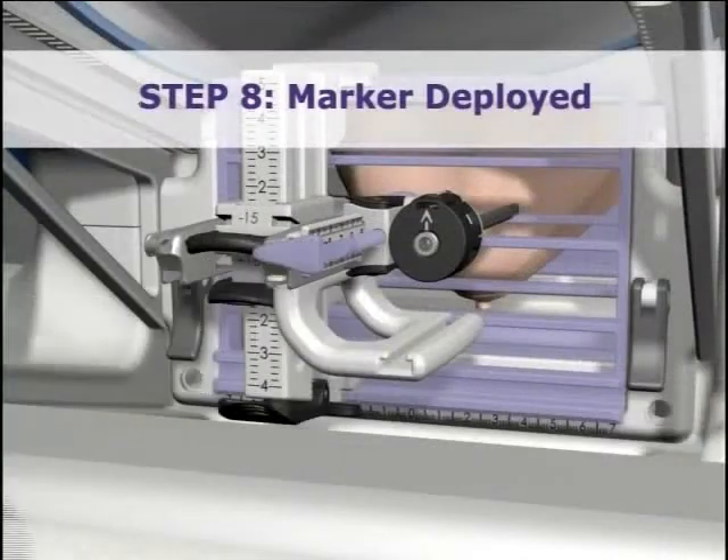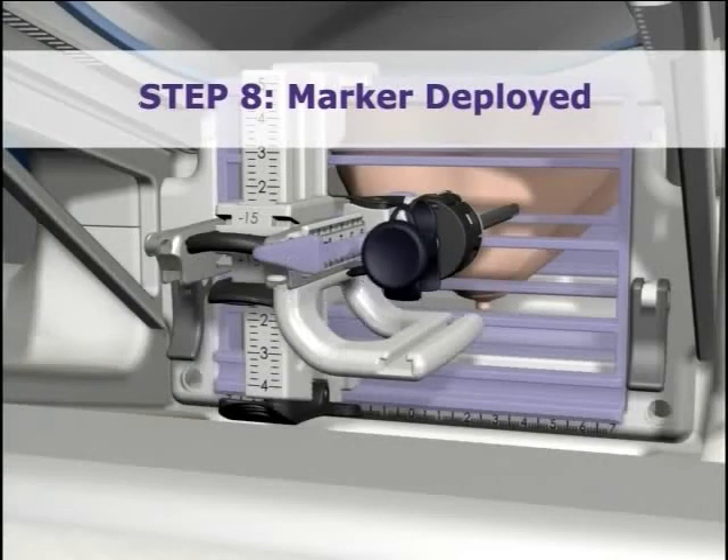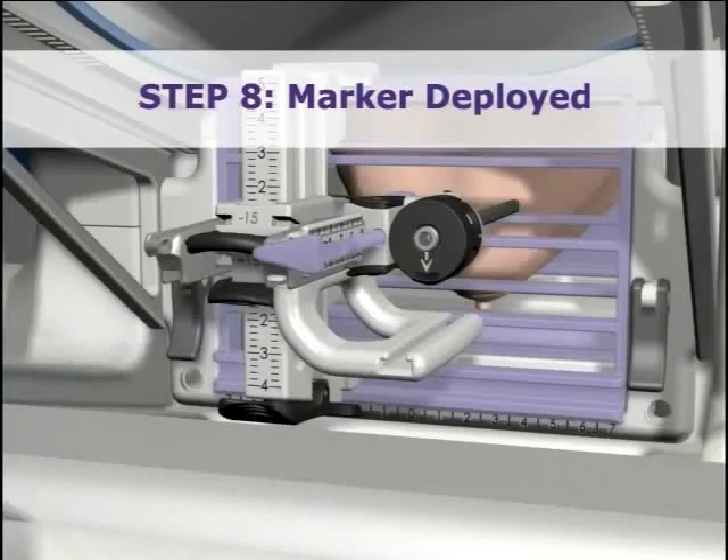To deploy the marker, remove just the obturator stylet cap. Insert the marker indicator into the sleeve and deploy. Rotate the thumb wheel with the marker still inserted to the 6 o'clock position. This will close the aperture and assure the marker is in position.